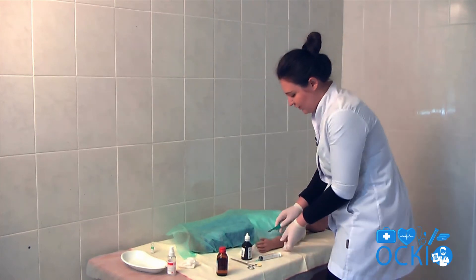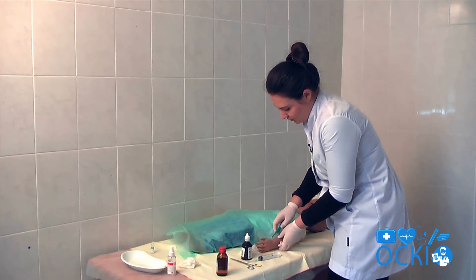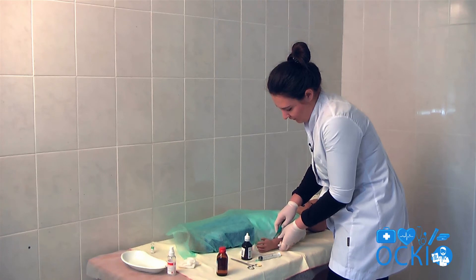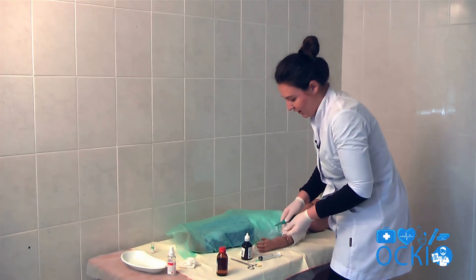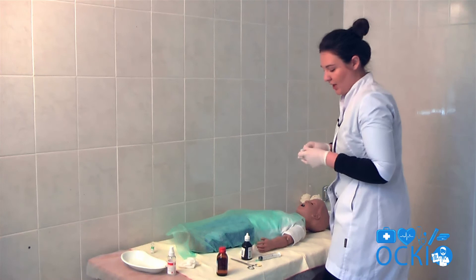Dissect the soft tissues of the abscess parallel to the nervous and blood vessels of this area.